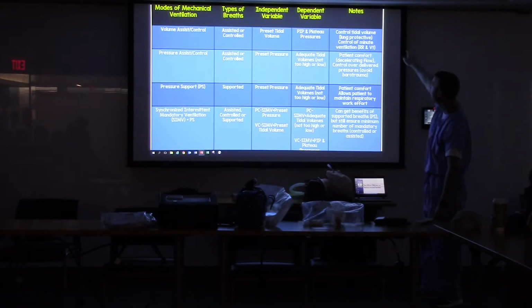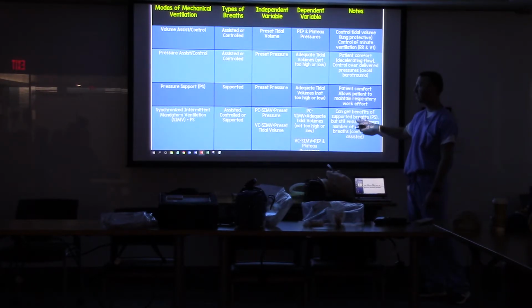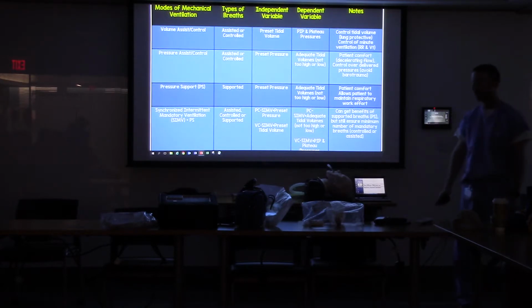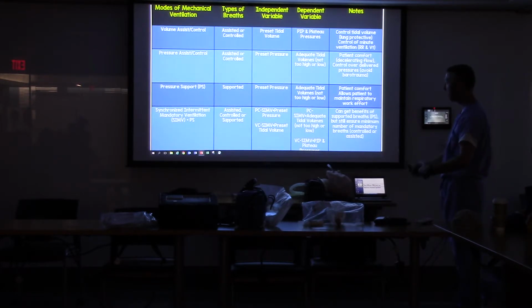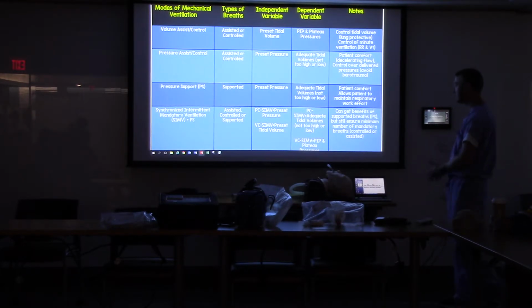And then here are some notes on what to watch for. I'll give you this in a sheet version so you can have it for reference. The goal is to eventually have a laminated placard with both ventilators, so you can reference it and be like, oh wait a minute, this is alarming, the patient's on this setting, I should do this, this, and this.